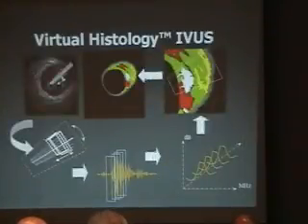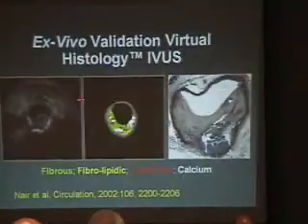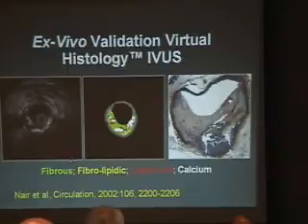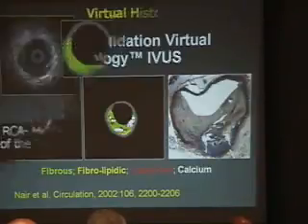It's a brand new technique which has been established by Cleveland. It is also using the radio frequency signal for tissue characterization. I will not tell you in detail, but clearly there is an attempt to use the IVUS information, the histology, and color-code the cross-section of the IVUS in colors corresponding to calcium, lipid core, fibrolipidic, and fibrous. There is very high expectation for these things. I think we have to be very, very critical, but certainly a lot of us are working currently on that issue.